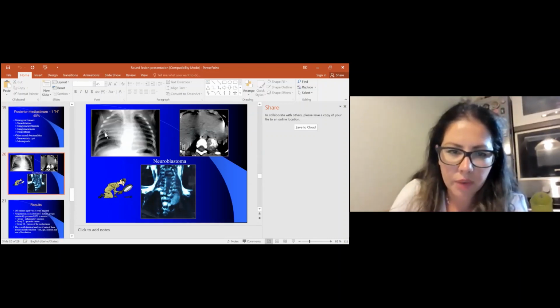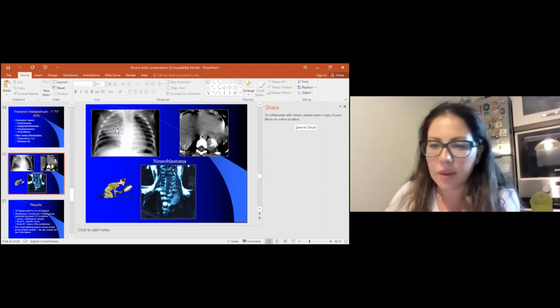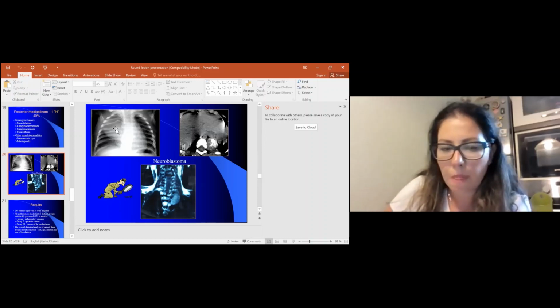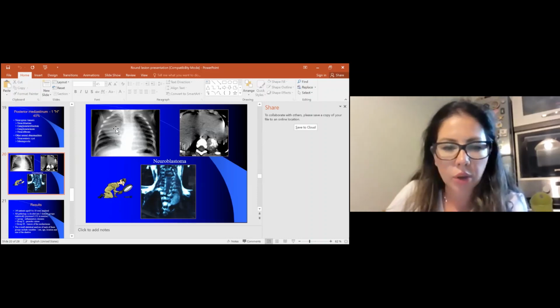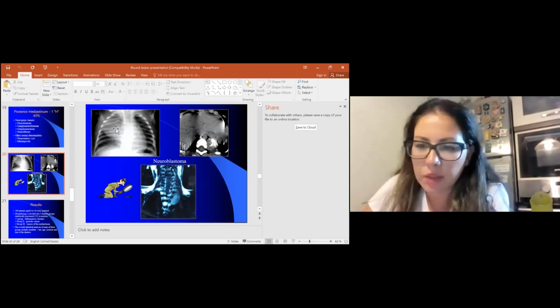Neuroblastoma. Here you can see the rib erosion, and that's why we made further investigation, because we already saw that there is rib erosion. So it must be, unfortunately, malignant. So where we should look, for analyzing the radiograms and not to make possible mistakes.